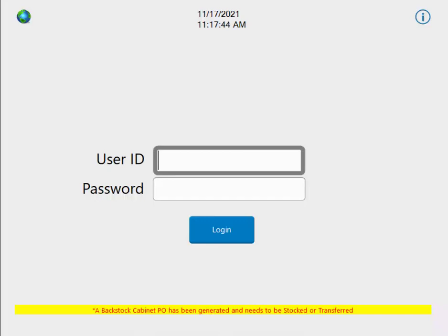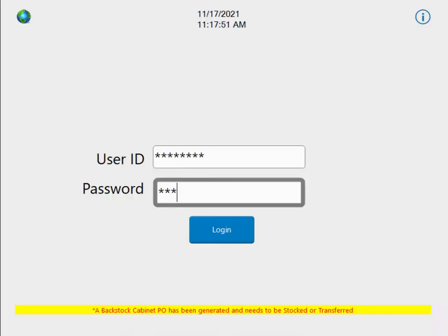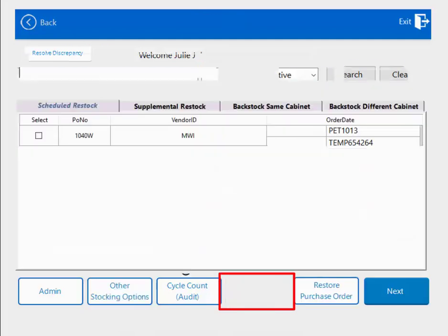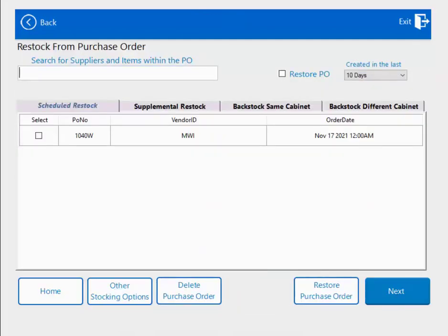First, log into your Qubex. You can either use your fingerprint or your manual login credentials. If you have restocking privileges, you will see the restock button at the bottom of the screen. Click restock. This is the restock screen. As you can see, there are now four tabs for the different types of restock.